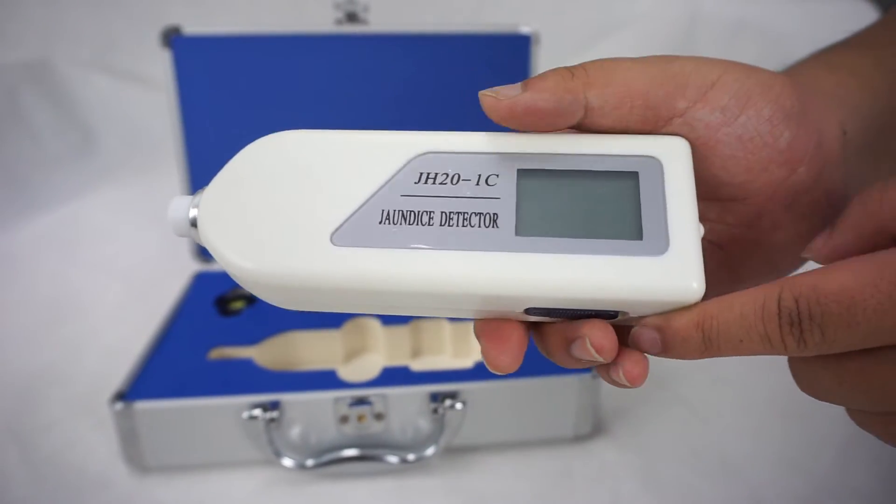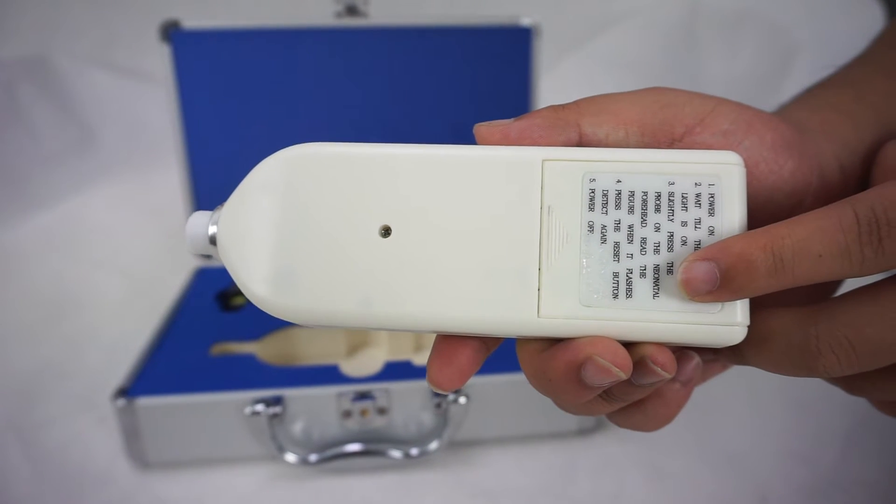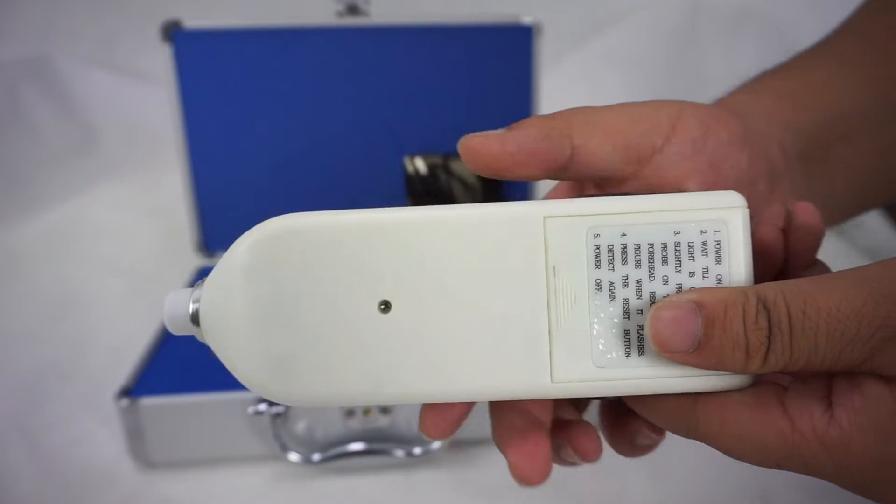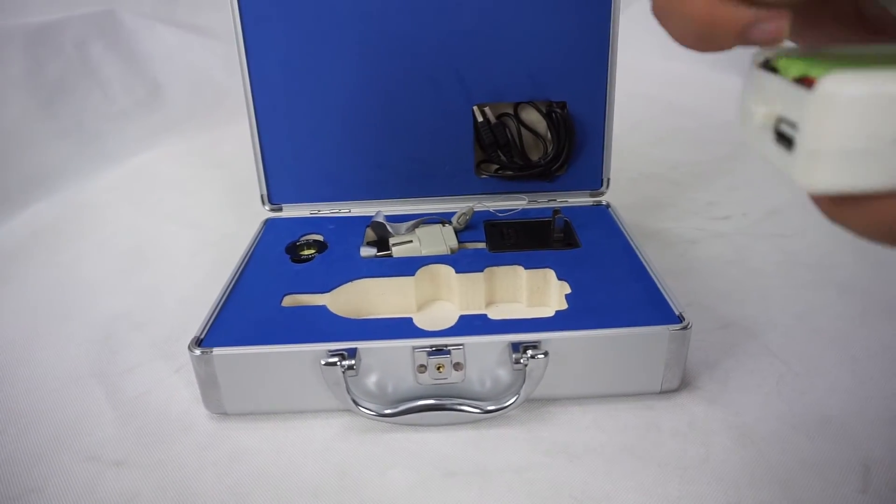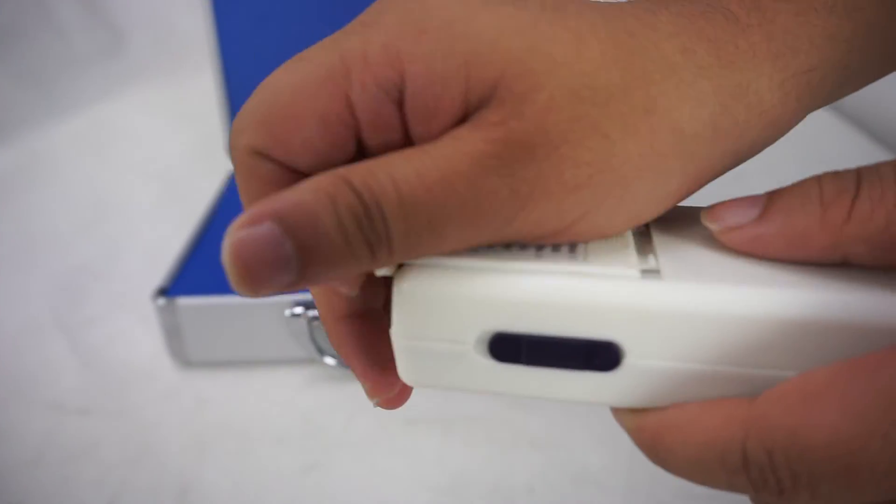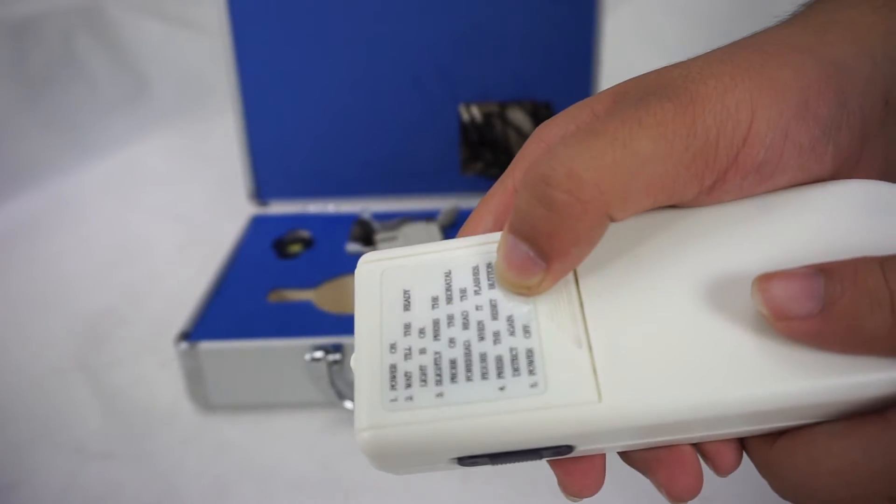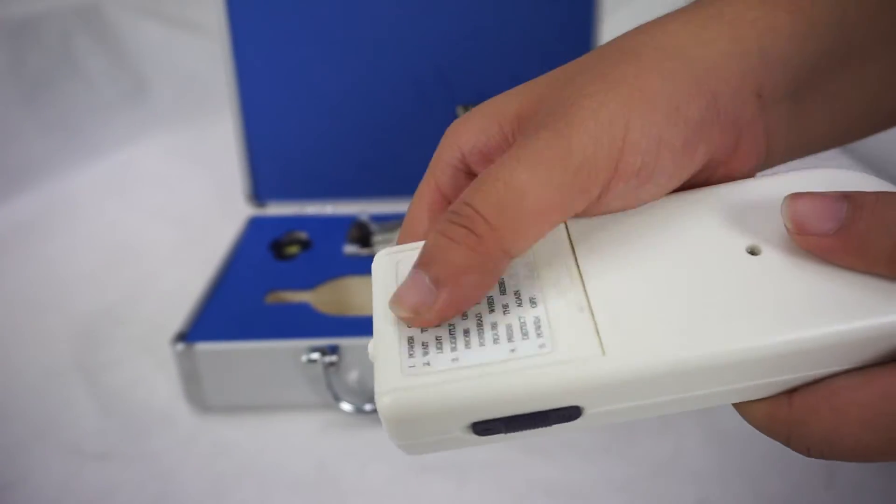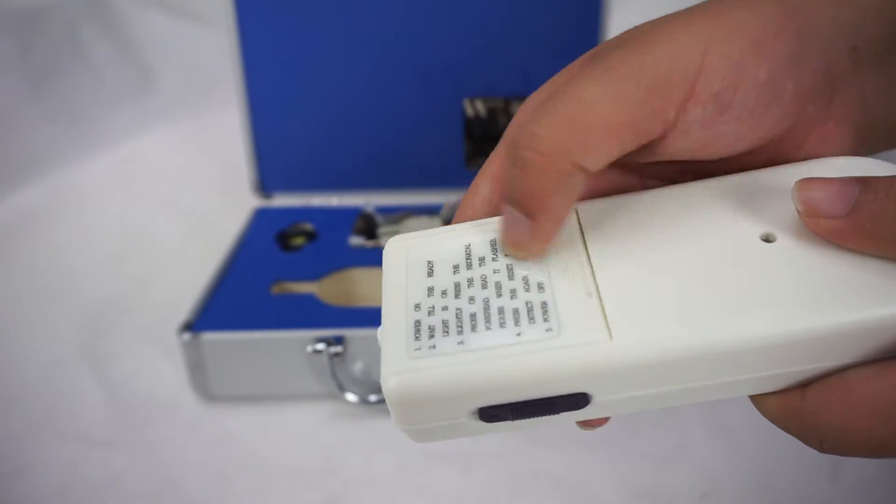And on the back is the battery box. In it, there is a rechargeable battery. And there are some words on the battery box to tell you how to operate the machine.